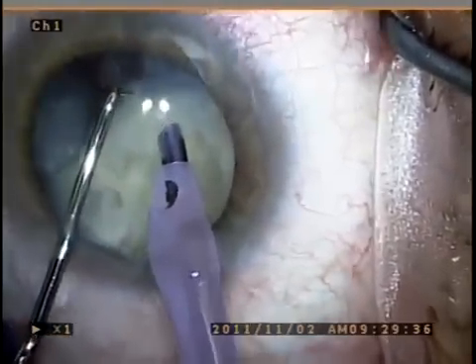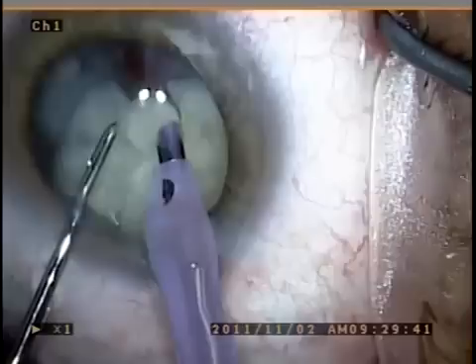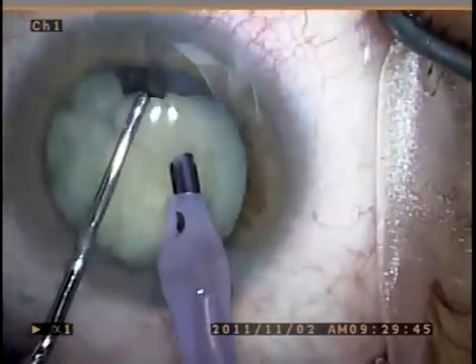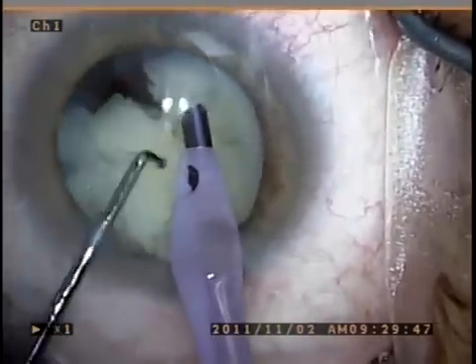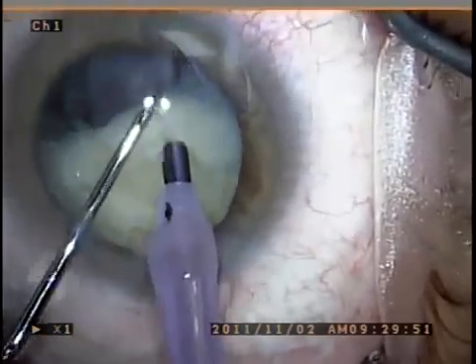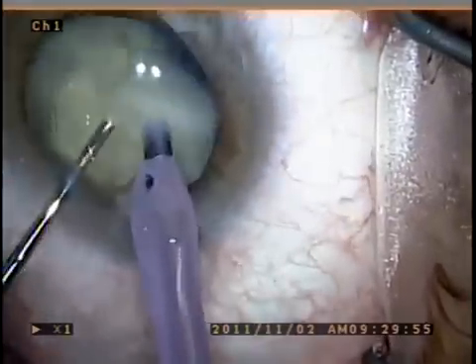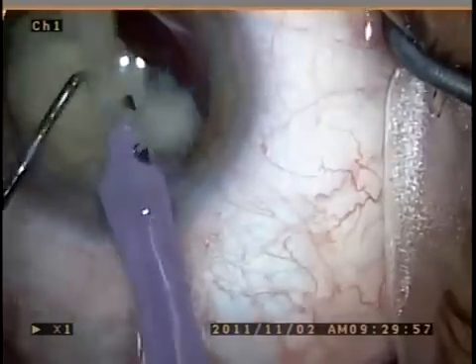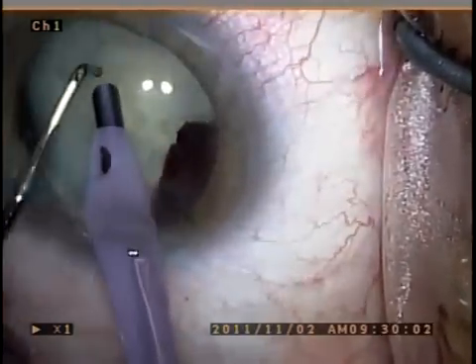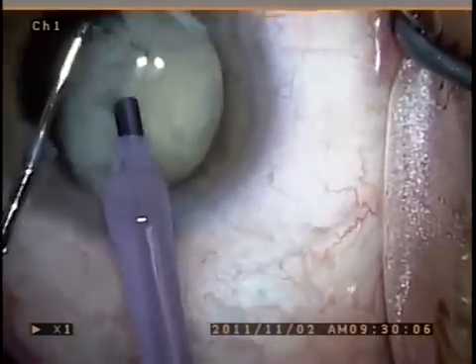I use a second instrument at this point to fracture the lens peripherally in a horizontal chopping technique in order to break it up into smaller, more manageable pieces. And then proceed to chew up the remaining lens in nice bite-sized pieces, if you will.